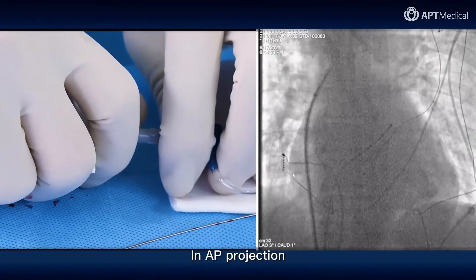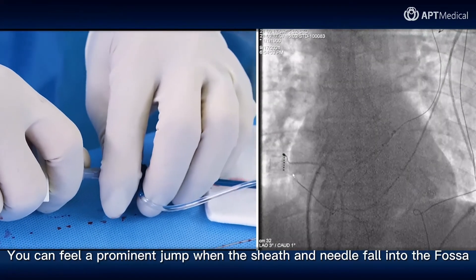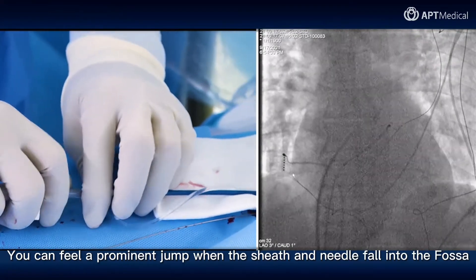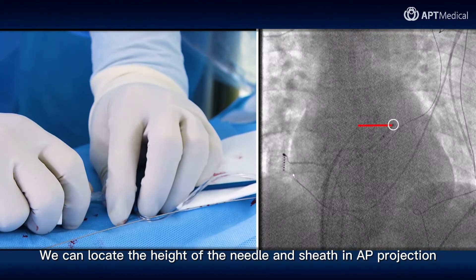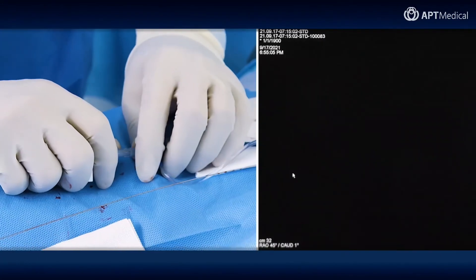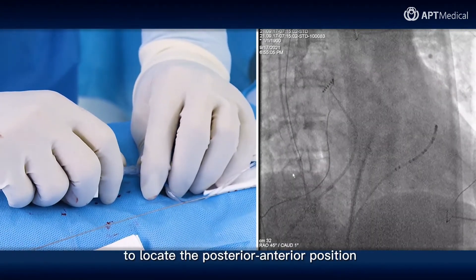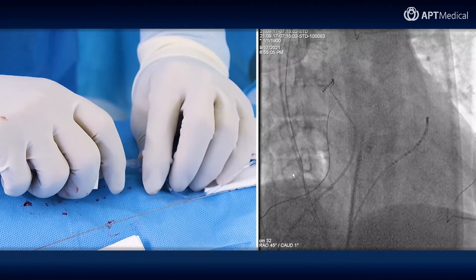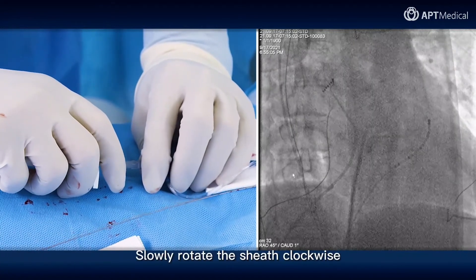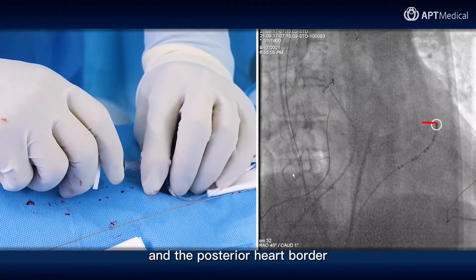In AP projection, slowly pull down the needle-sheath complex. You can feel a prominent jump when the sheath and needle fall into the fossa. We can locate the height of the needle and sheath in AP projection. In RAO 45-degree projection, locate the posterior-anterior position. Slowly rotate the sheath clockwise to position it midway between the distal part of the CS catheter and the posterior heart border.